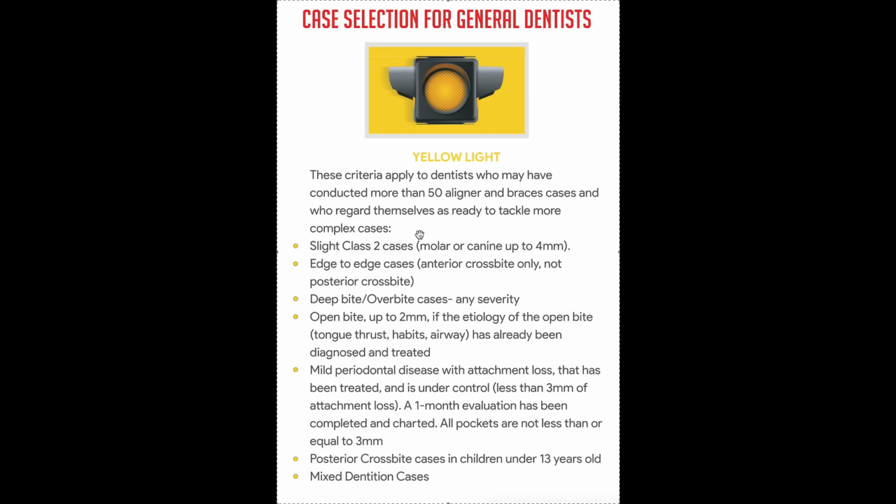We're going to have to check that. If you're going to take these types of cases, you need to have a way to either take a sagittal slice CBCT or a ceph on every single patient. If you do not have that ability, you should not be taking yellow cases. And this I really have to hammer home, because there's a lot of dentists who have skills, but they're not getting the right diagnostics. That opens you up to liability because you're just guessing on the treatment plan.